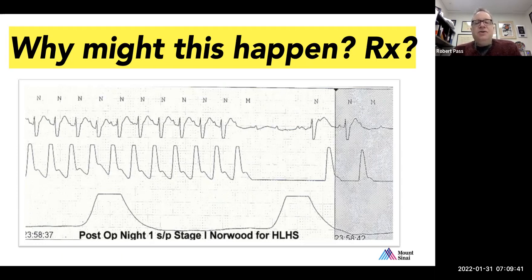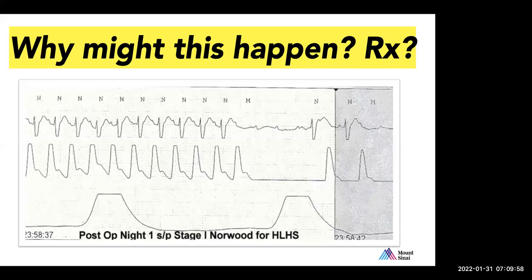So now let's go back to Mahmoud. Mahmoud, of those descriptions that Tarek just nicely outlined, which of those do you think would have been the most likely to potentially cause this problem that we're observing on this tracing? I would say the reconstruction of the aorta.